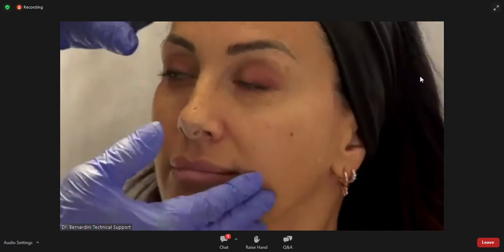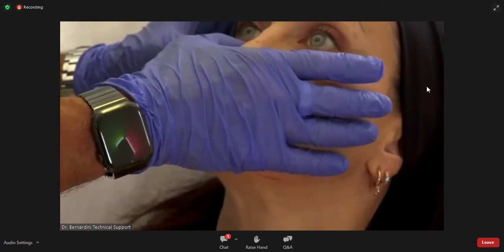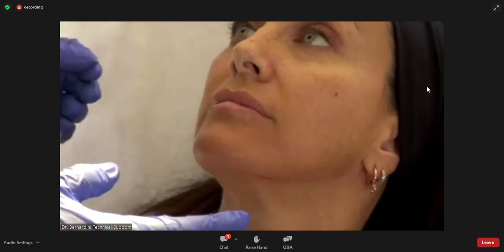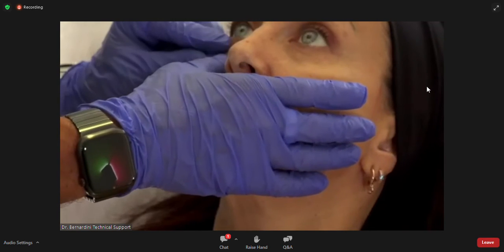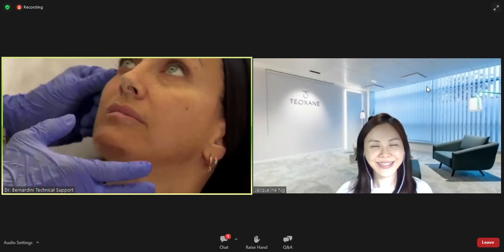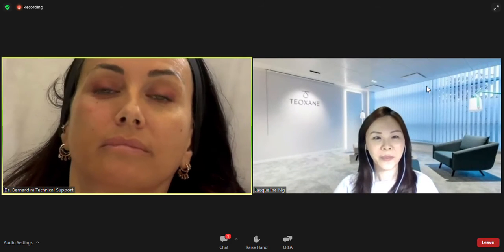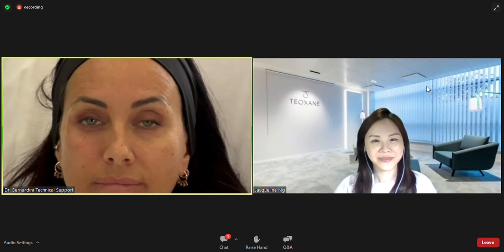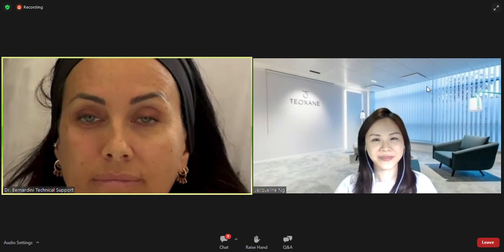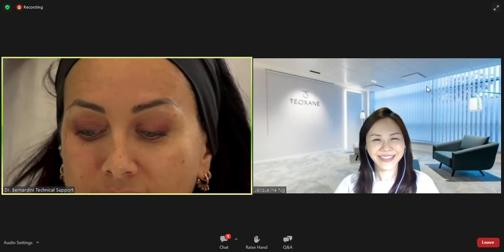So, Jacqueline, I have a quick question for you. I'm already done with one side. I don't know if you have questions, comments regarding what we have achieved so far. It's really nice for me to see, despite the mishaps of the treatment that make it even more exciting.